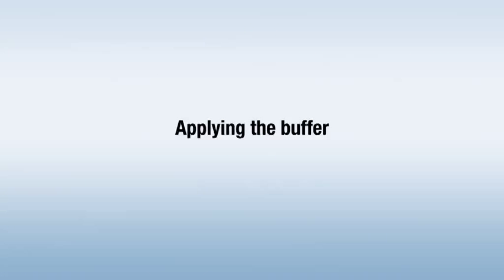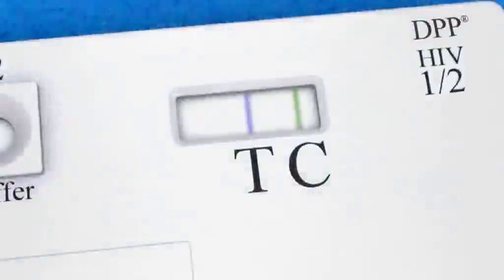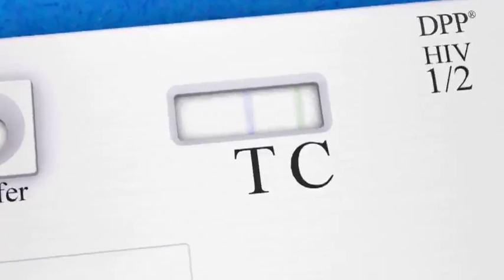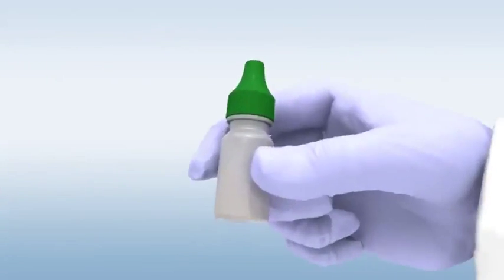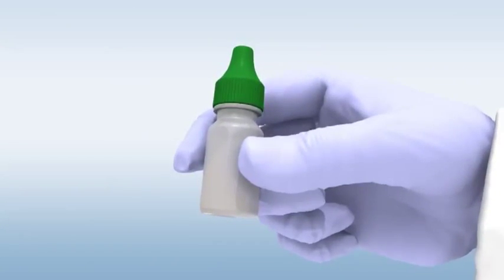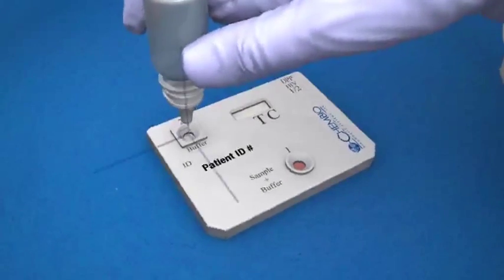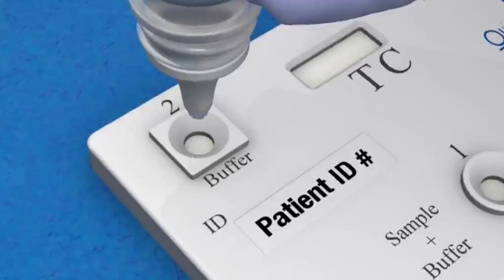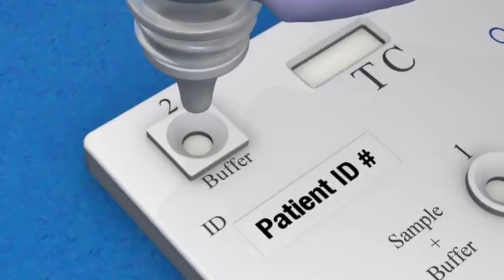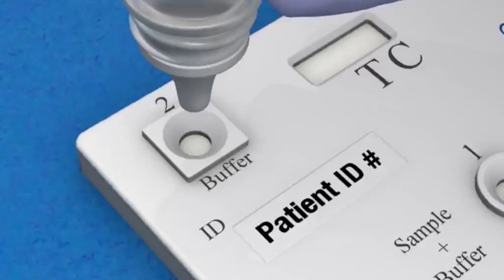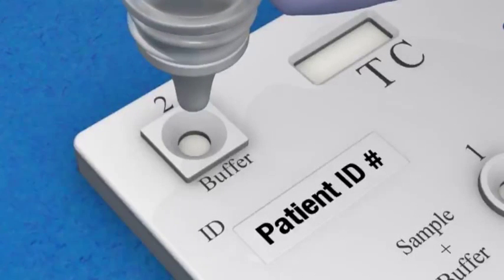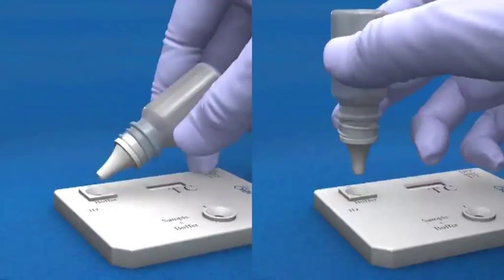Applying the buffer: Ensure that the colored lines have disappeared from the test window before you apply the buffer. Then remove the green cap of the running buffer bottle. Hold it in a vertical position but upside down, and gently apply four drops of buffer into the square buffer well, again without touching the bottom of the well with the tip. Be aware that holding the bottle sideways will produce invalid results.